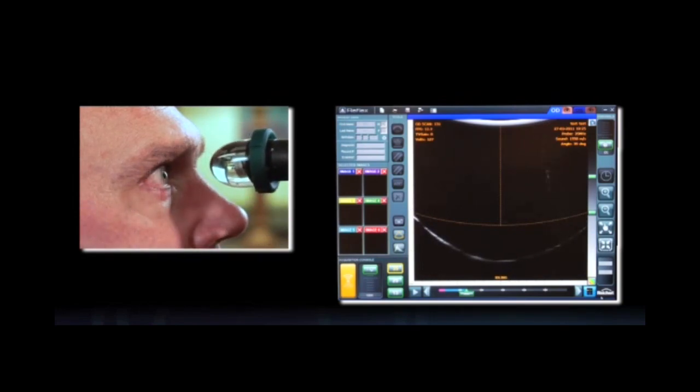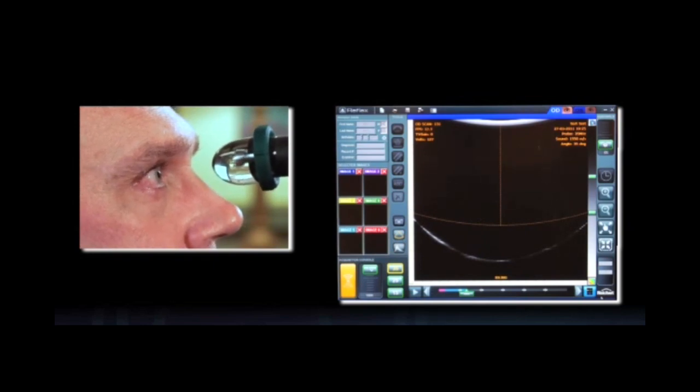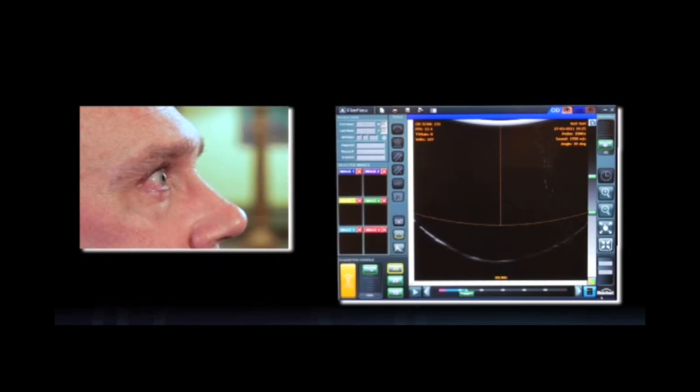I'm going to have the line facing temporally and going across the eye, and that will give me that same orientation. If I move to the left eye, I keep the same orientation. On the left eye, the line's going to be facing the nose, and the opposite side, where there is no line, will be facing the ear. And I have the same orientation of nasal and temporal as if I were just looking at the patient under a slit lamp.